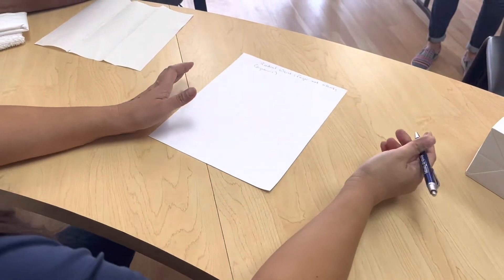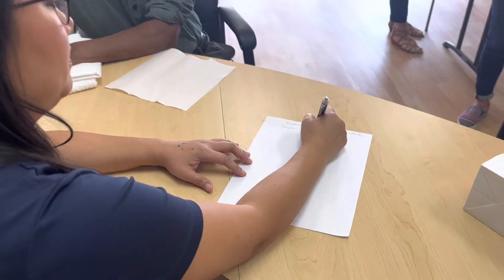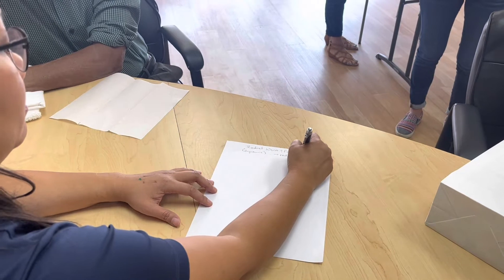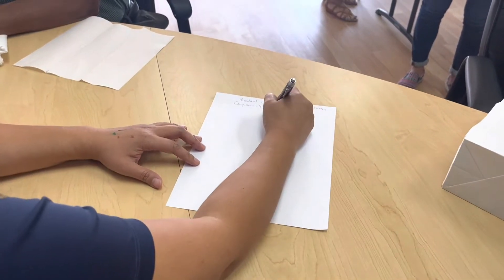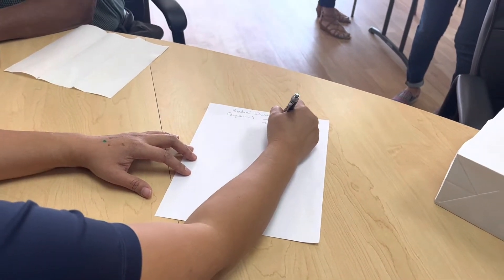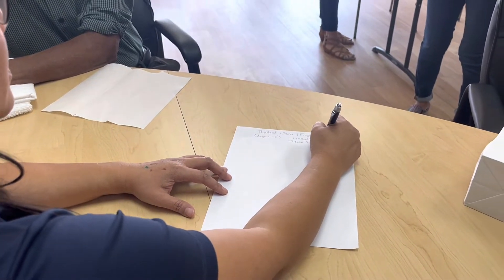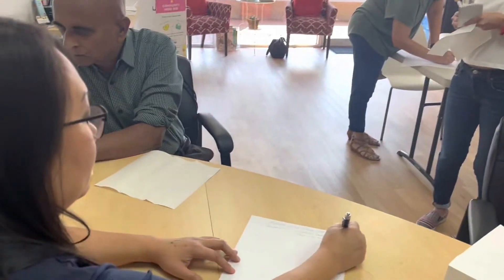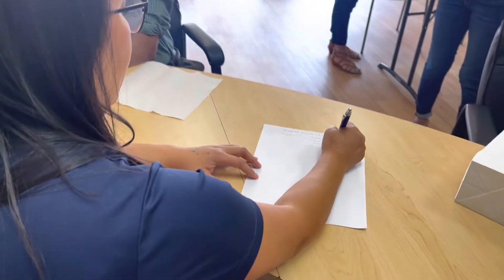This is very specific for radial palsy. You can also use this for a zone five or six extensor tendon laceration or repair.